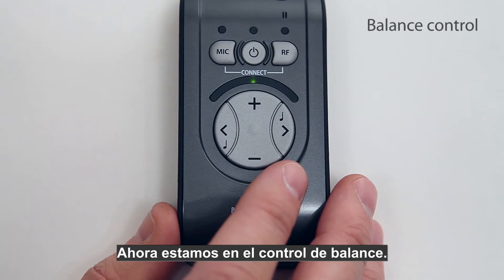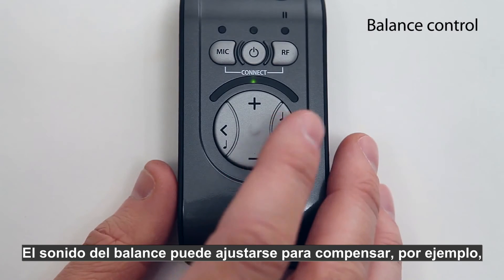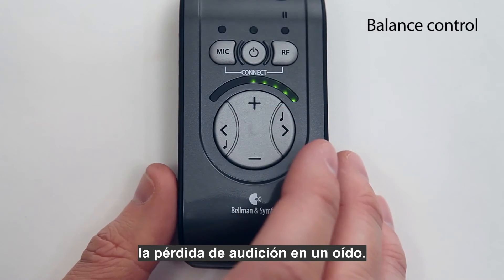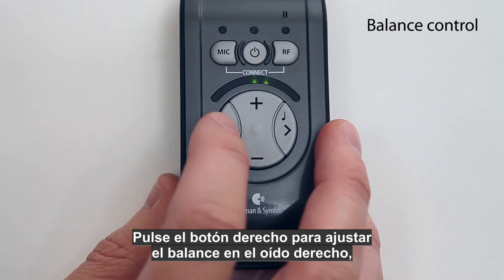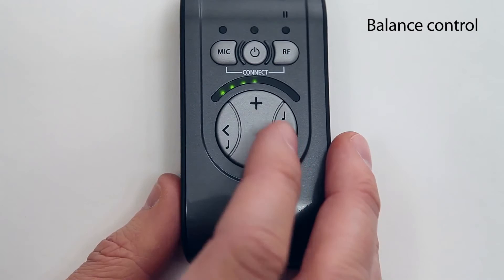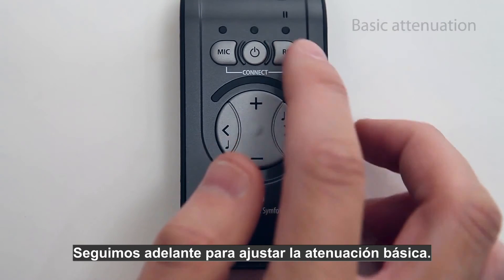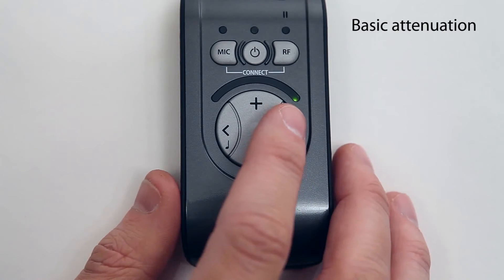You are now in balance control. The sound balance can be set to compensate for, for example, hearing loss in one ear. Press the right button to adjust the balance to the right ear and the left button to adjust the balance to the left ear.